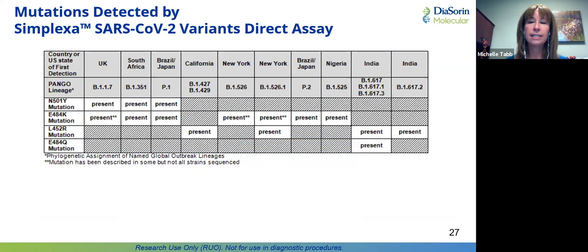And I'll just highlight that once again, looking back at that reference chart. So if you go across here, if you have N501Y and L452R, actually, we don't see any of that type of variant yet, at least being reported out with a great enough frequency to make the variants of interest or variants of concern list. And so that might be something interesting for your lab to sequence if you happen to detect it with this assay.